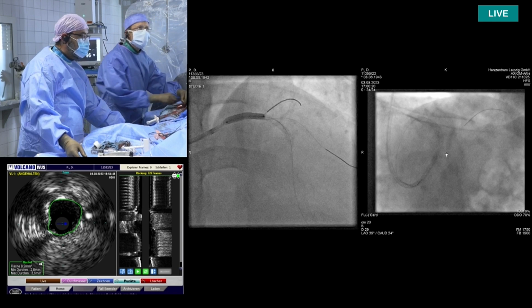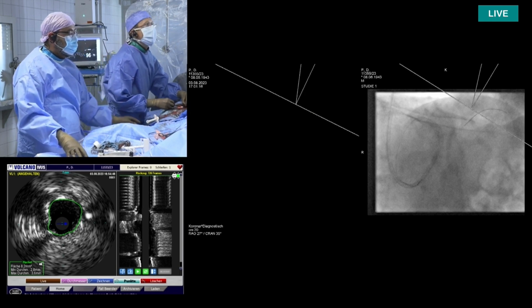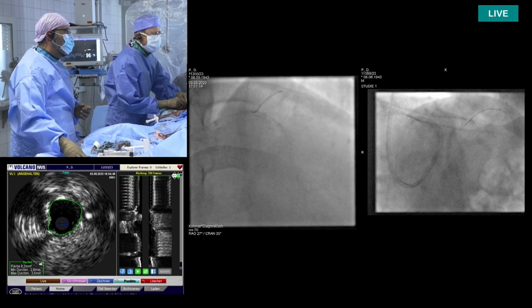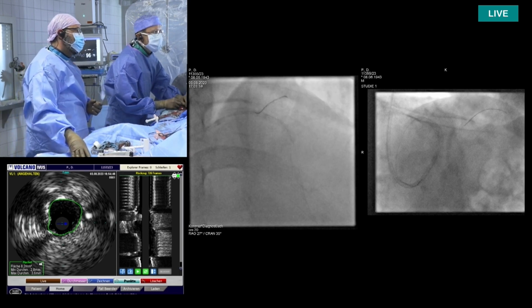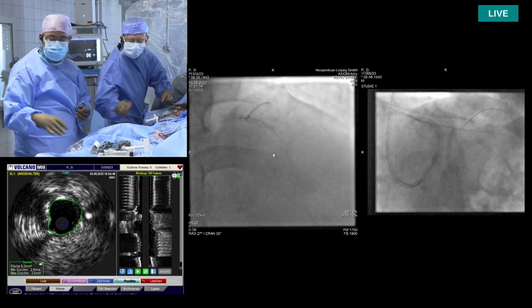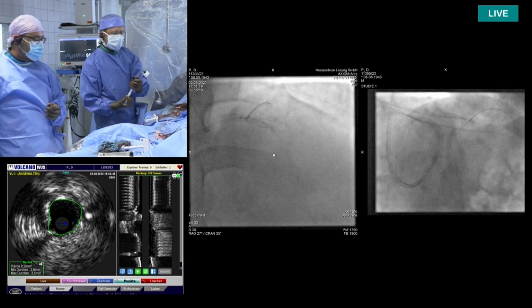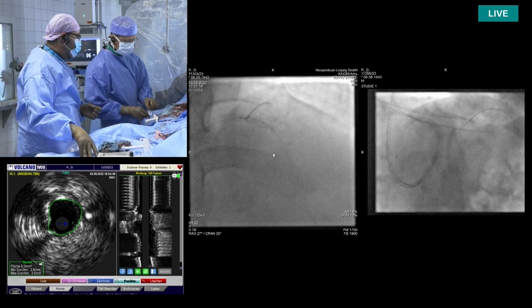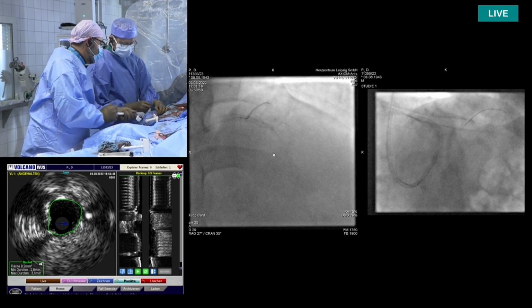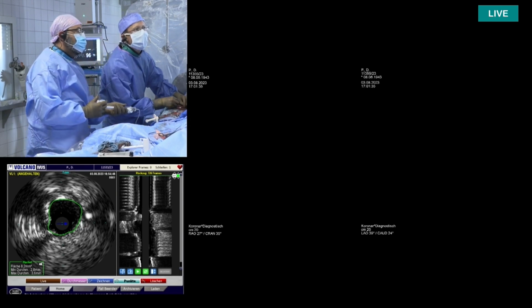The majority of the stents we currently have are very flexible, very thin, almost all cobalt chrome. So maybe the radial force is lower, or there is some recoil if we implant them, for example, in a chimney situation. And the Megatron may be one of the stents that has better characteristics, less recoil.